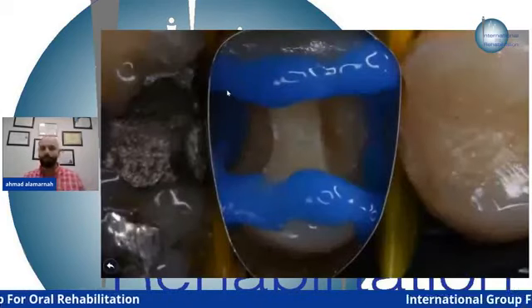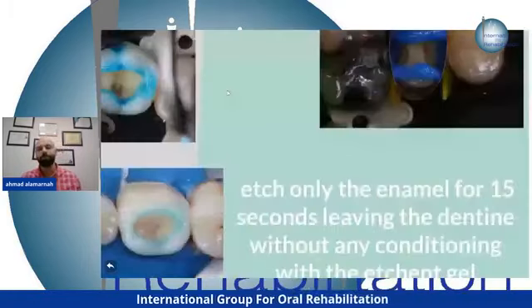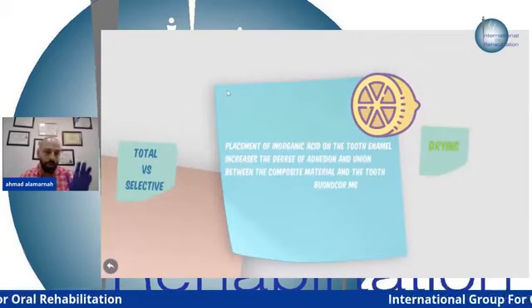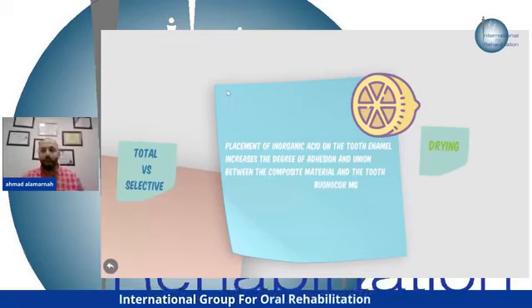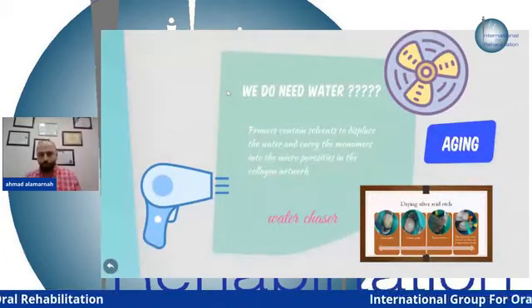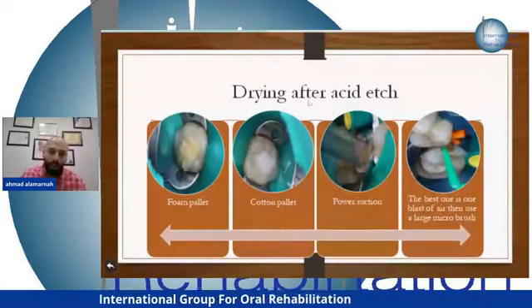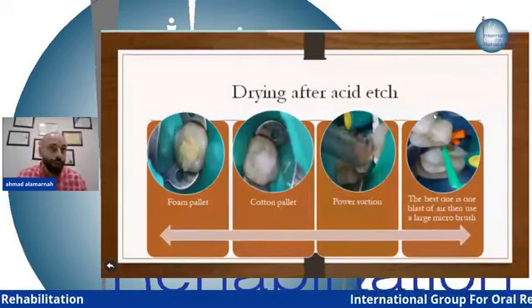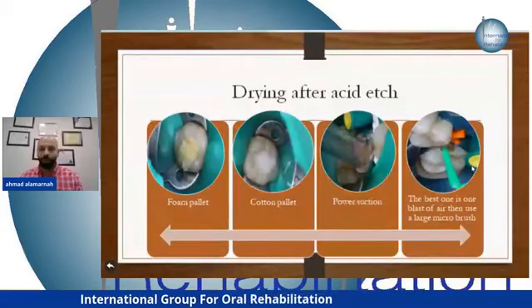Different brands of acid etching have different consistencies, different colors. After you do your acid etching, you have to remove it. You have to rinse it. How to remove it and dry it, okay? You can do it like this, with the power suction, with a clean bond brush without any fluids or liquids on it, okay?